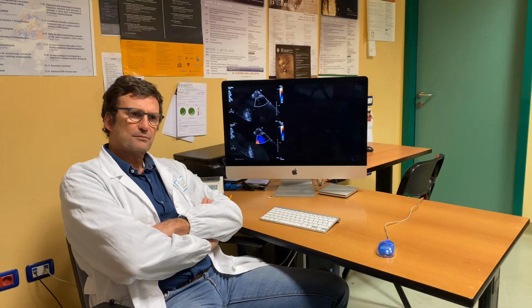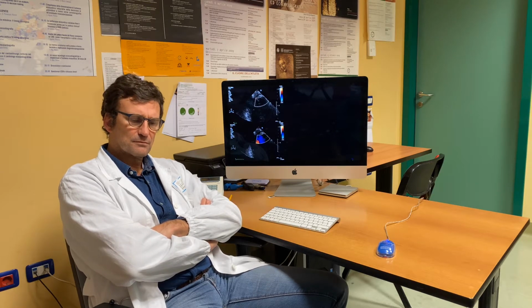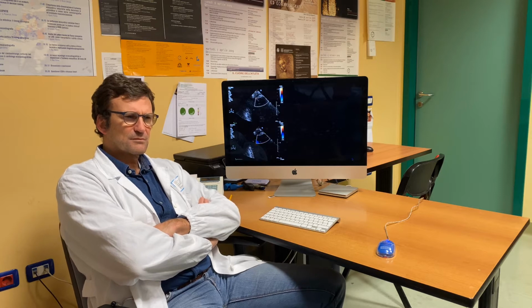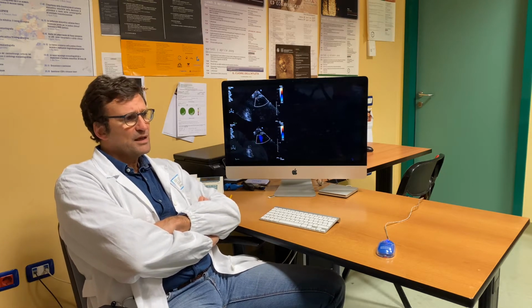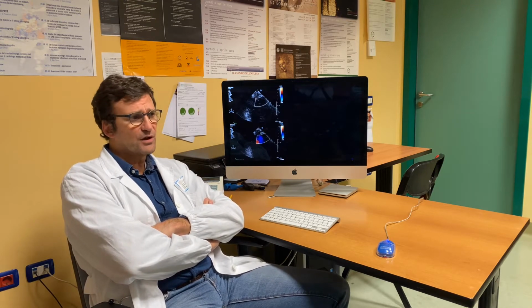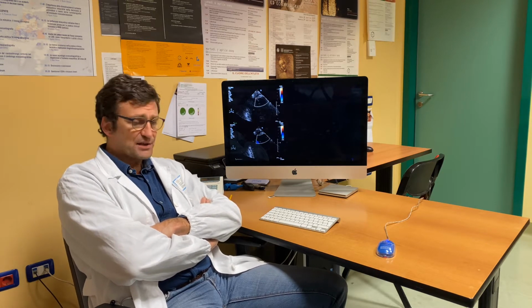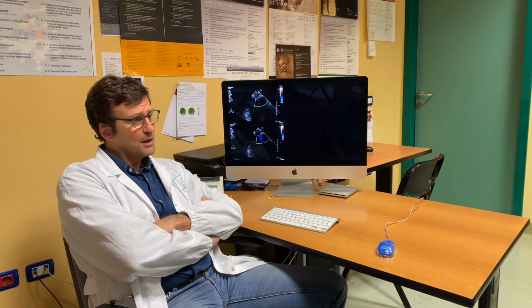Okay, thank you. Talking about stress echo, one of the parameters is CFR, coronary flow reserve on the LAD. How do we detect it, and what is its clinical importance? Yes, coronary flow reserve is an important adjunct to the stress echo parameters that you can assess during stress echo, in particular during vasodilator stress echo.